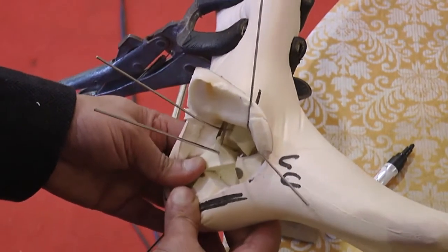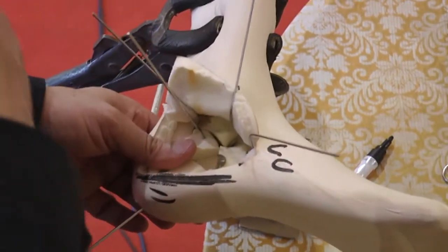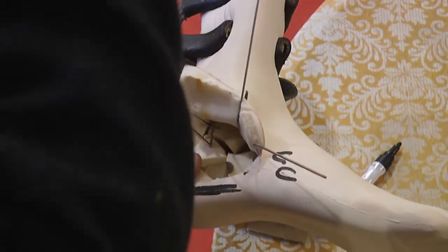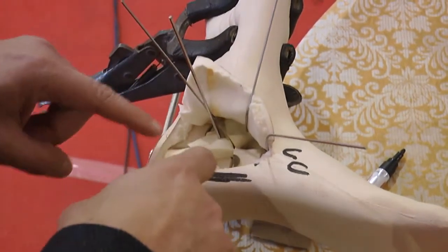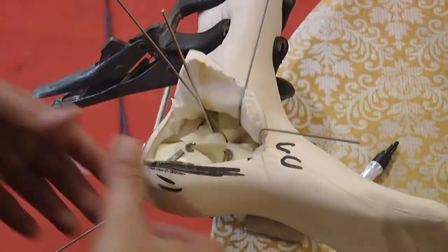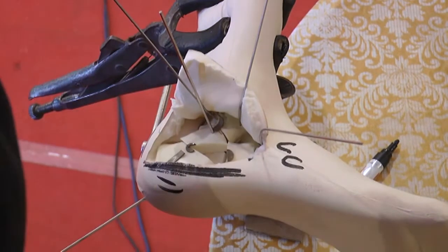If you really want to look at the joint surface, there are a couple of options. If you just do a heel inversion at this stage, most of the times you are not able to look at the fracture line. So if you have a small distractor, the Hintermann distractor which I showed in the video, you can put one pin in the tuberosity and one pin in the talus and distract it and see that the joint surface has been reduced well.